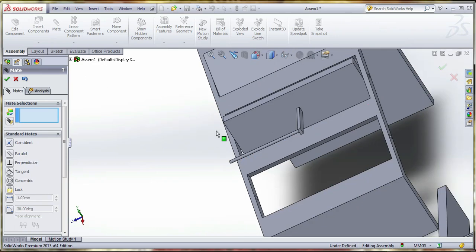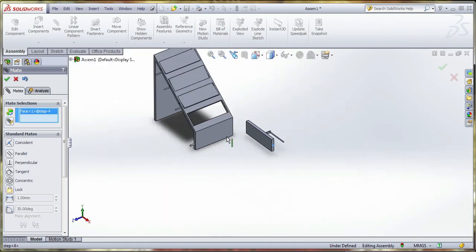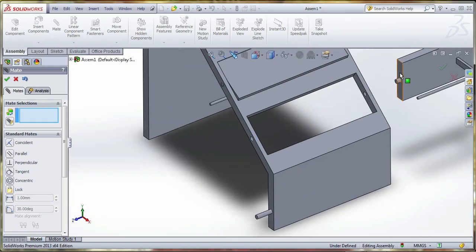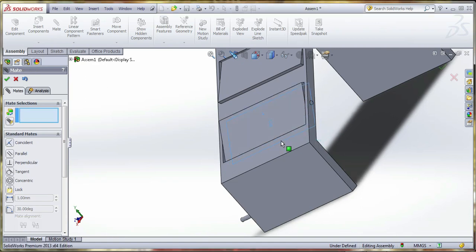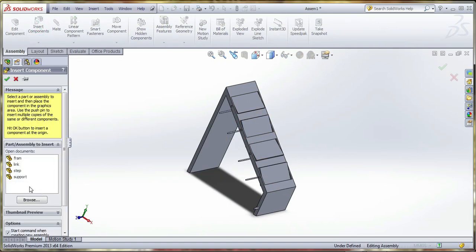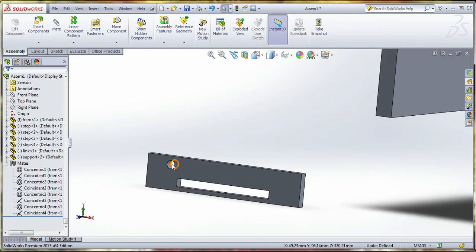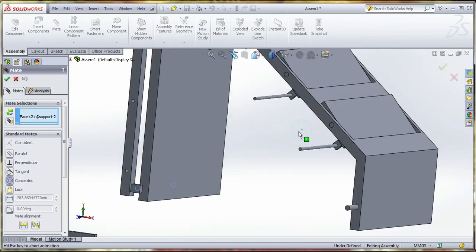Okay, the same for another step. Select the pin internal surface and select the side surface internal surface. Okay, step is completed, and then select the support. We're going to fix the steps and the link.